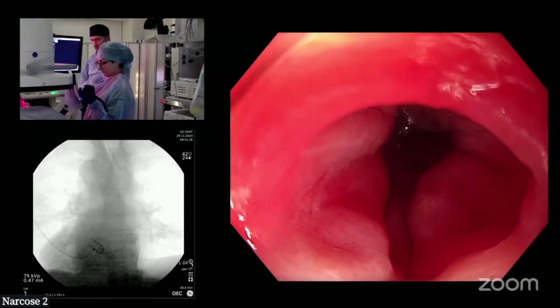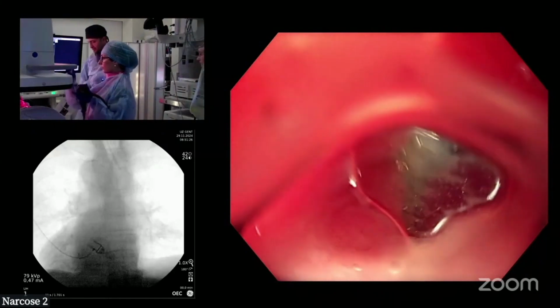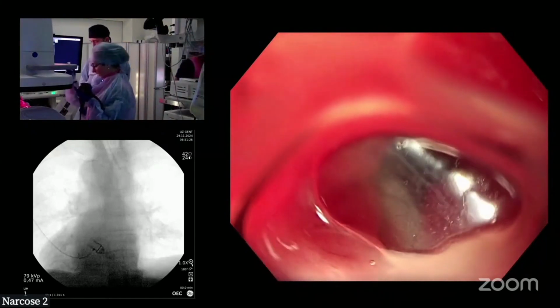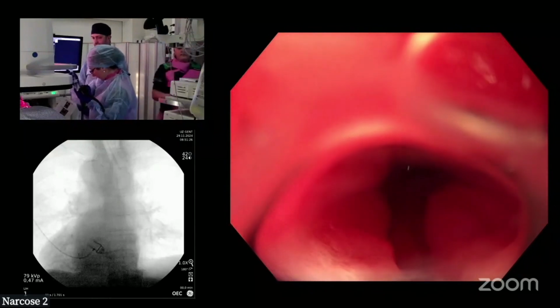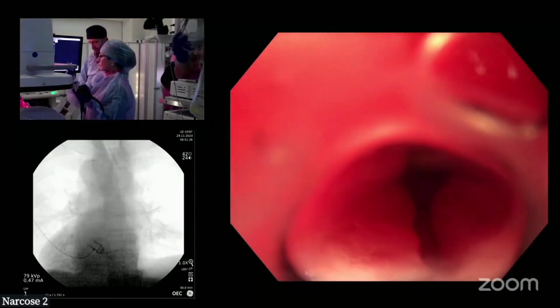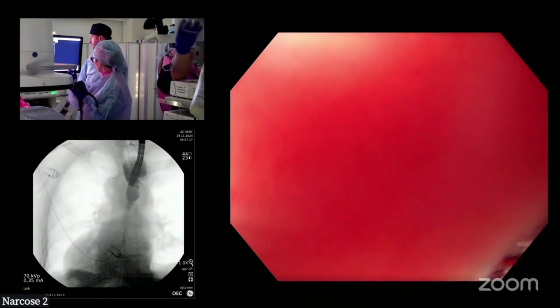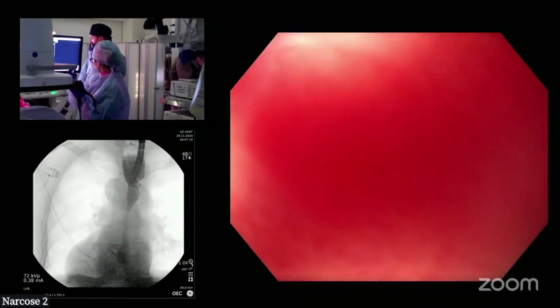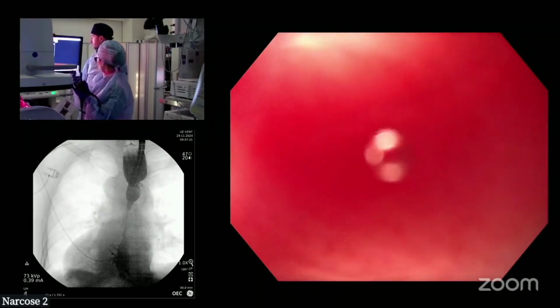You can flush all that down there. What is this? How many? 50%. Okay. And you can step on the, yeah, put the half and then put your foot on there. Yep. Okay. Go. Go again. More. Stop. Okay. So we already know what we need to know.